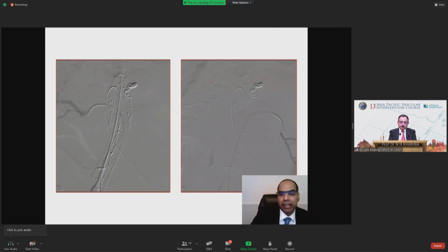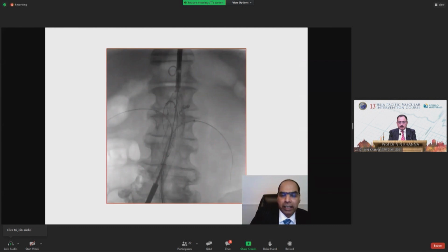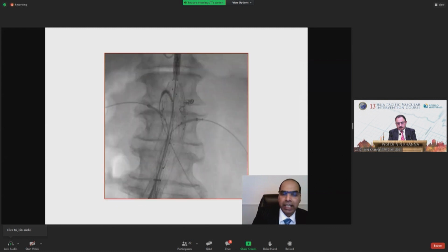And in sequence, the right renal and the left renal artery are cannulated and confirmed, guide wires passed, and once the support wires are in the target vessel, appropriate Cook sheaths are tracked into the target vessels, and within these sheaths, target vessel stents are also tracked, position, everything confirmed, and at this stage, you are still seeing the anterior and the posterior markers and the check mark.